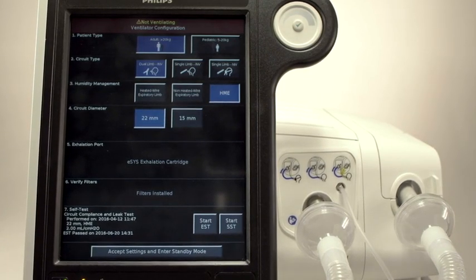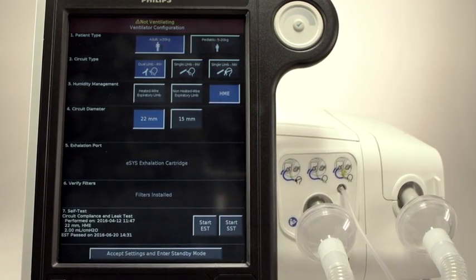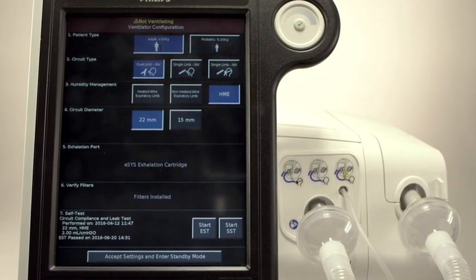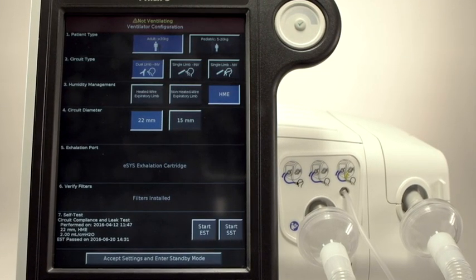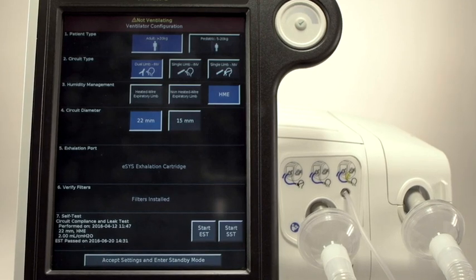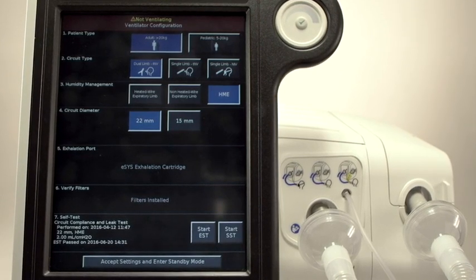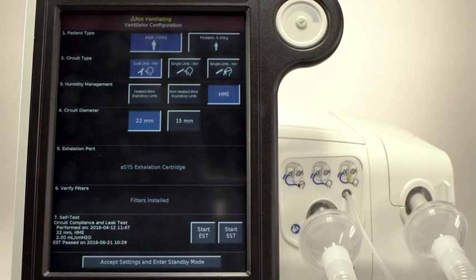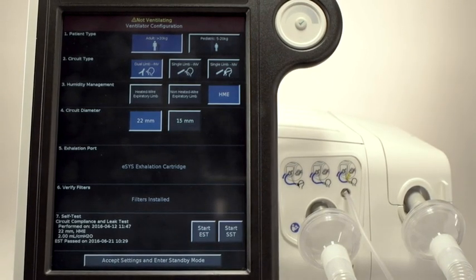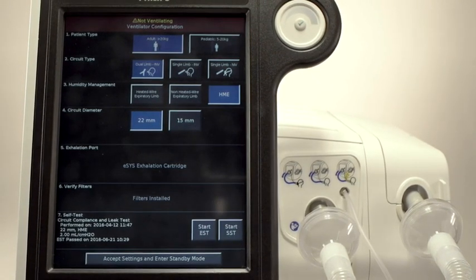You must be connected to a high-pressure oxygen source to perform the EST. The short version is recommended after each circuit change and does not require high-pressure oxygen to run. Since we are changing to a dual-limb circuit on the same patient, we don't have to run a new EST. However, we will want to select SST.